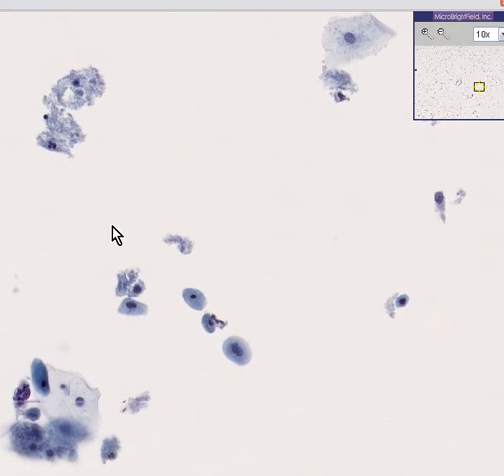And the reason why it's called atrophy is the following. As surface squamous cells mature on the surface, they go from these cells with very large nuclei, like here and here and here. They mature towards the surface to these cells with very small nuclei and abundant cytoplasm. So in the basal cells, the NC ratio is high, and in the more mature surface cells on the surface, that NC ratio is low.